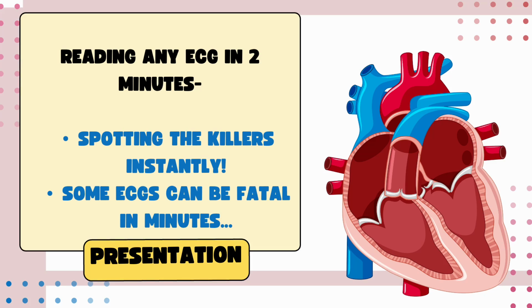Have you ever stared at an ECG and felt like drowning because it was looking a bit confusing? This is how you're going to get through it. It's very simple, and we can break it down into fast life-saving steps that will be very, very useful for you. So let's just get to the point.